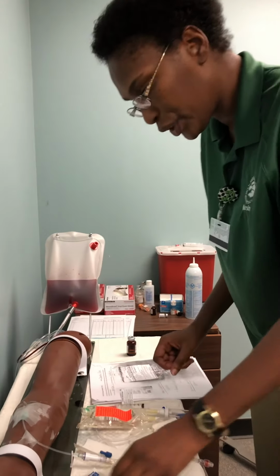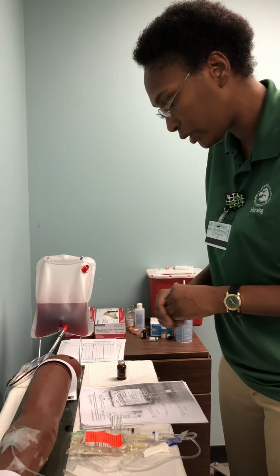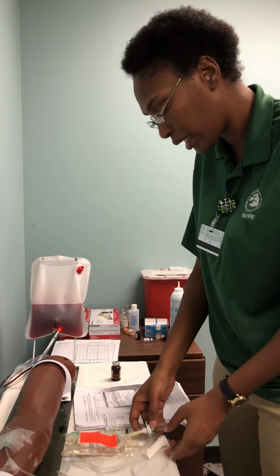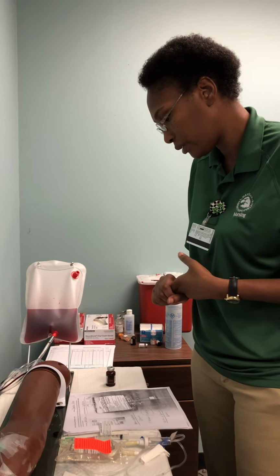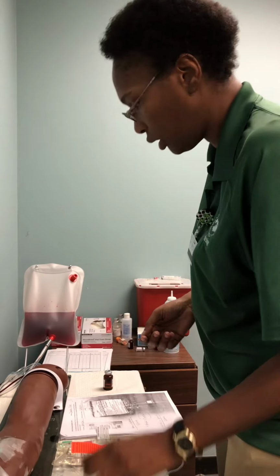Now that I got my medications prepared, I've checked the expiration date, I've checked the bag for any particles, didn't see any, and the expiration date on the bag, which was good. I checked for medication allergies, correct dose, route, and rate of administration. I'm going to my patient's room.